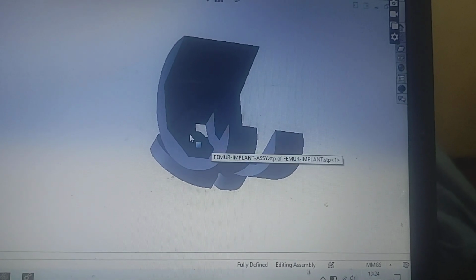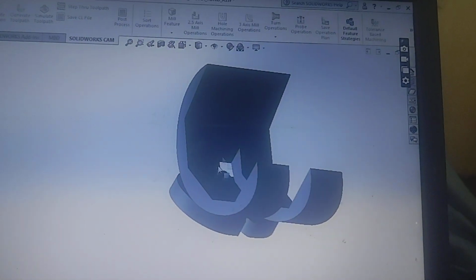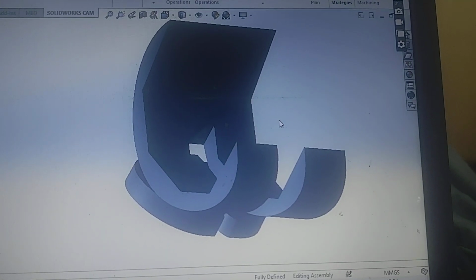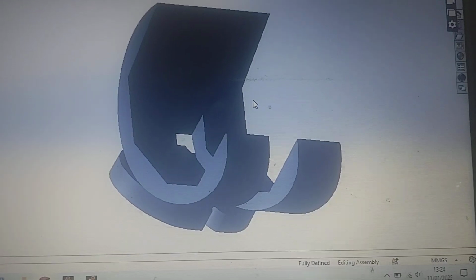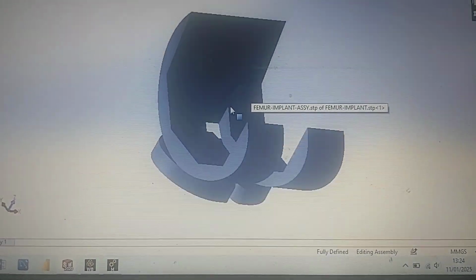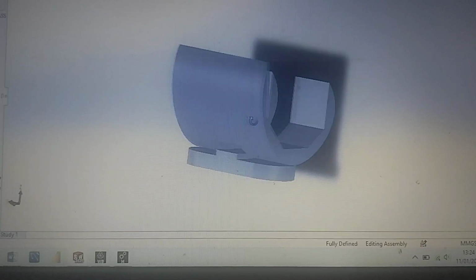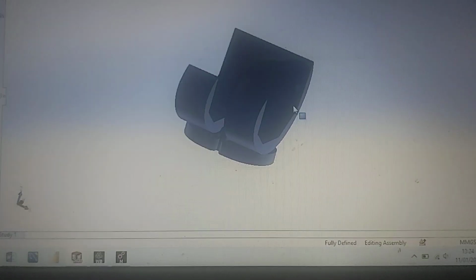Basically, the design was completed by using Solidworks. As you can see, the Solidworks 2020 interface. Basically, this is a knee replacement design. You know that many patients have lost their knee due to some accident or age factor. So this is the knee replacement implant in bioengineering or orthopedics.